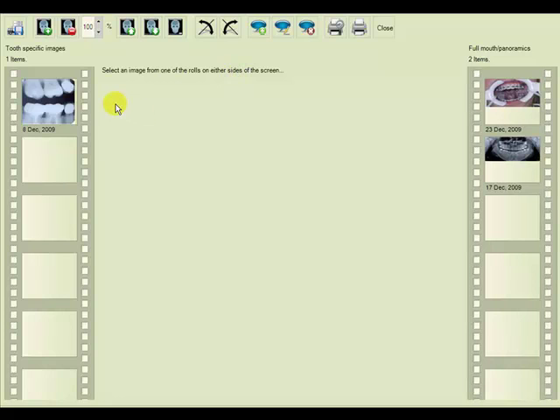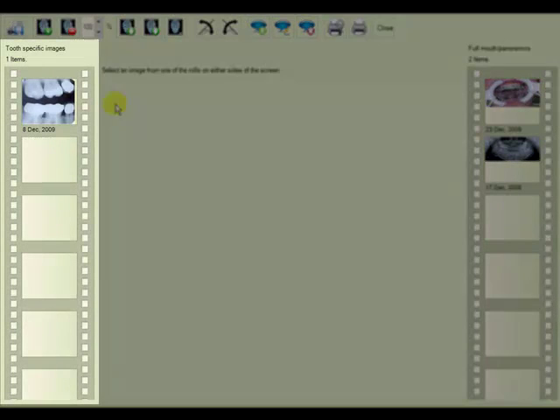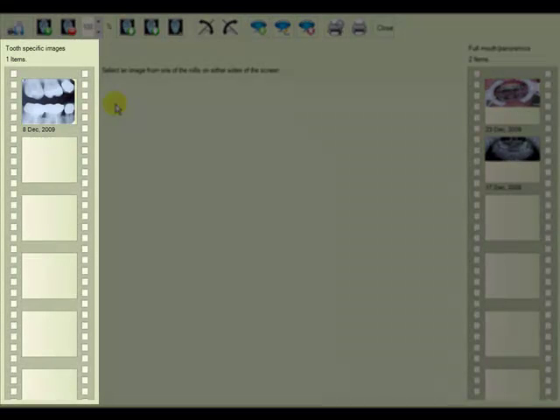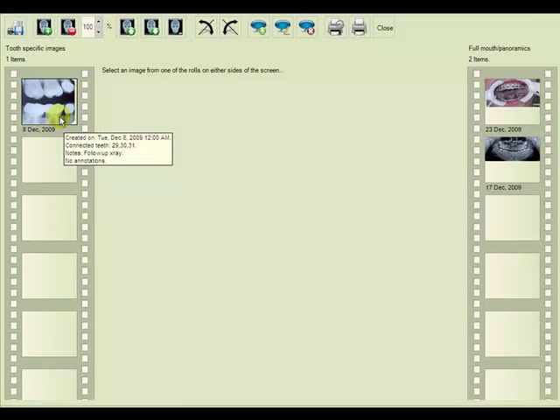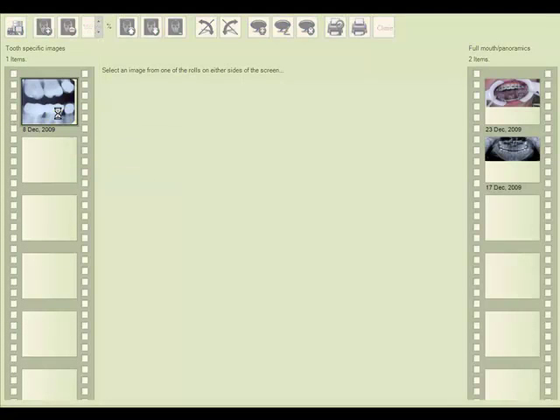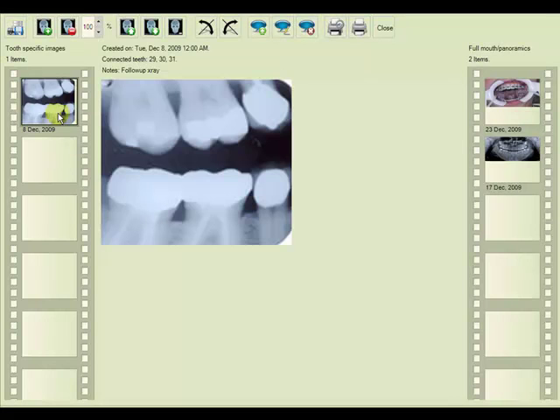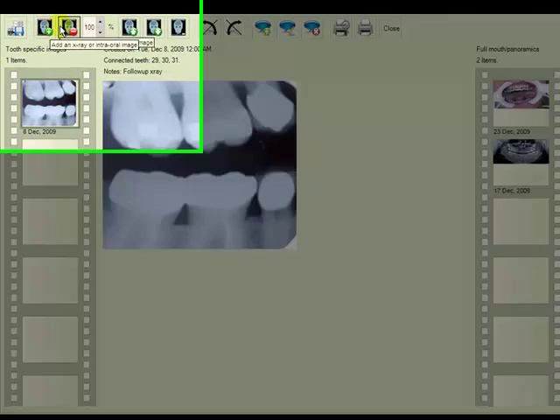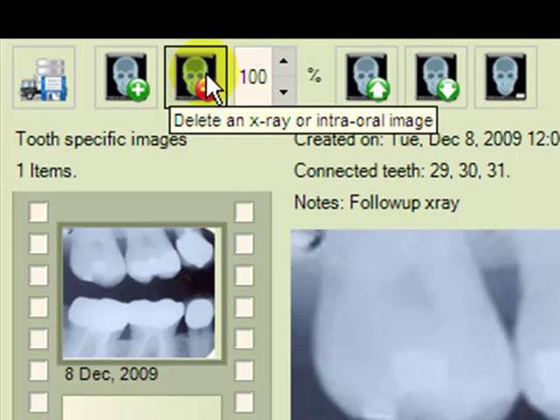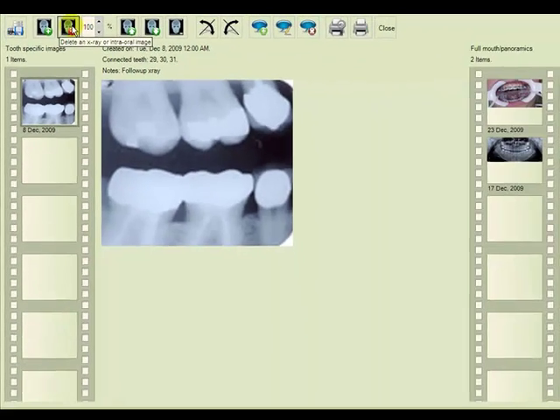Now we see that on the left hand side only one X-ray shows. We'll choose this X-ray and then choose delete an X-ray or intraoral image from the toolbar at top.